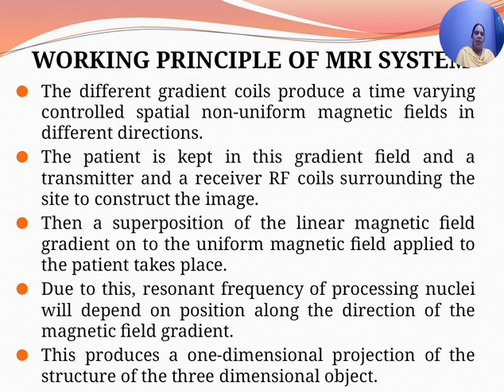As I told you earlier, there are three different gradient coils located within the main magnet. Each one of these produces a different magnetic field, each less strong than the main field. The gradient coils create a variable field along X, Y and Z, which can be increased or decreased to allow specific and different parts of the body to be scanned by altering and adjusting the main magnetic field.